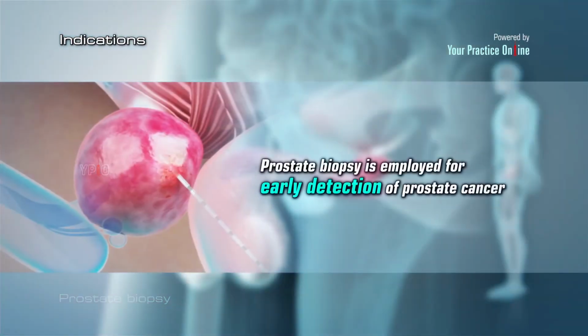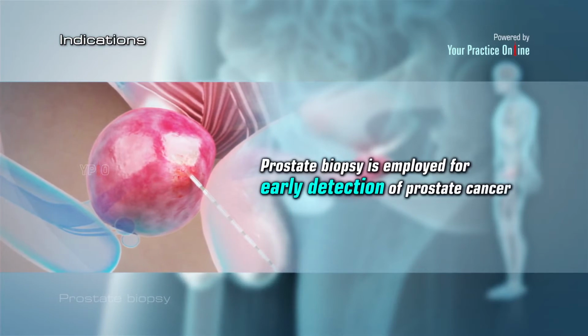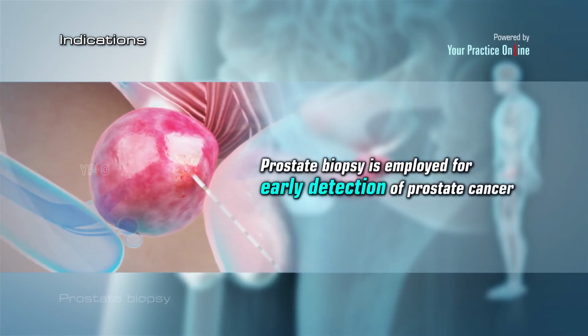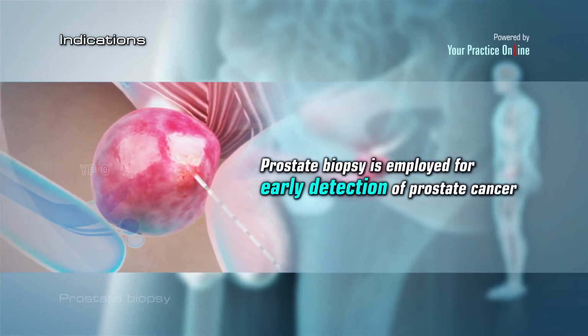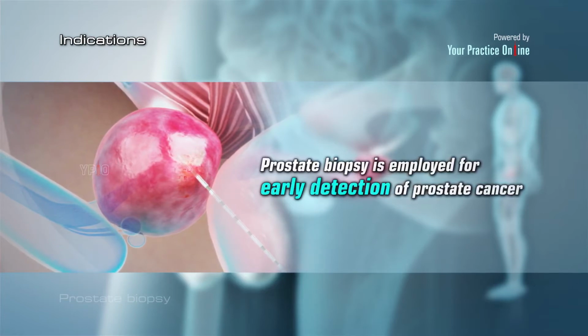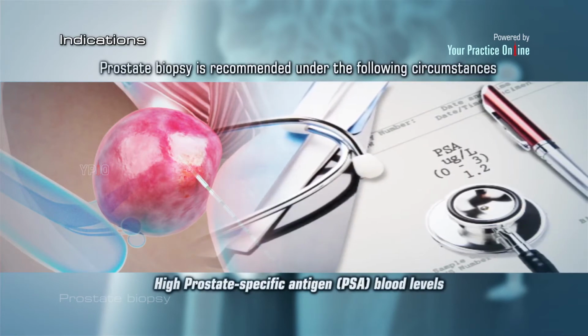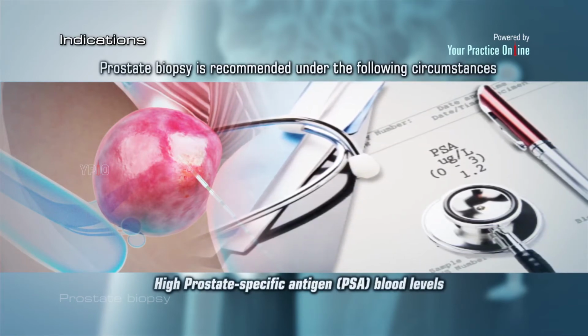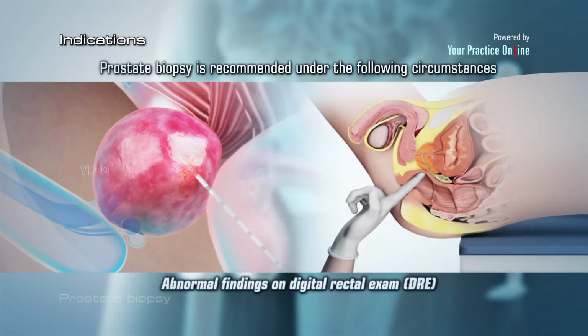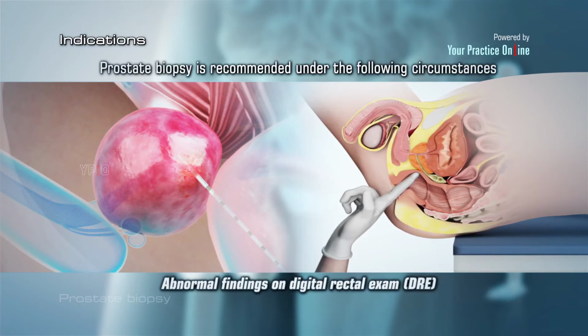Indications for prostate biopsy. A prostate biopsy is employed for early detection of prostate cancer. It is recommended under the following circumstances. The prostate-specific antigen (PSA) blood levels are higher than normal. Abnormal findings are detected during digital rectal exam.